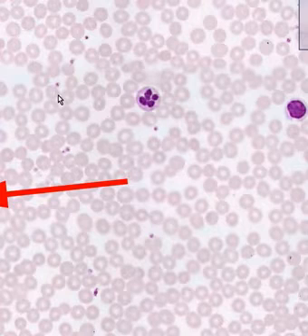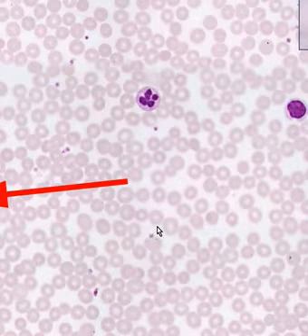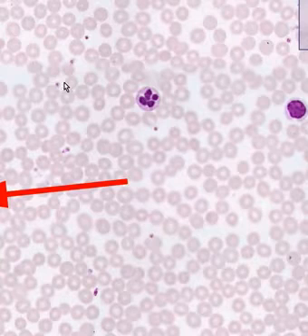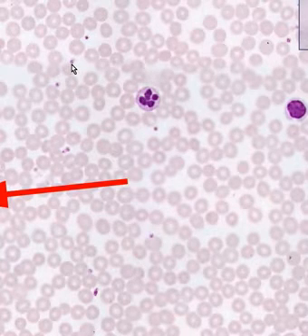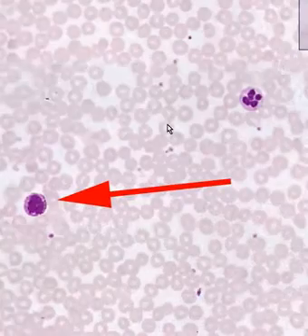All of these little dots, which look like little flecks of material, are platelets. Sometimes they are between the red cells. Sometimes they overlie partly or fully the red cells. And there's about 150 to 400,000 platelets in an average cubic millimeter of blood.